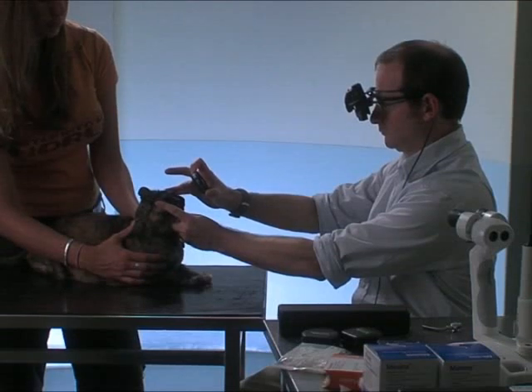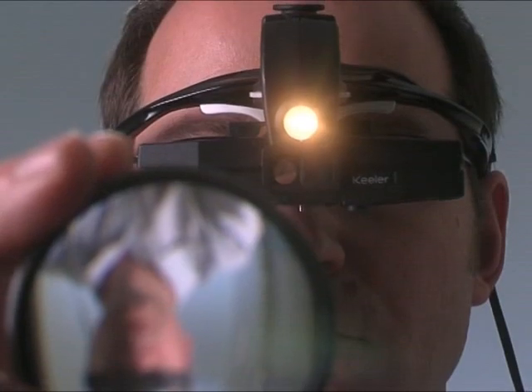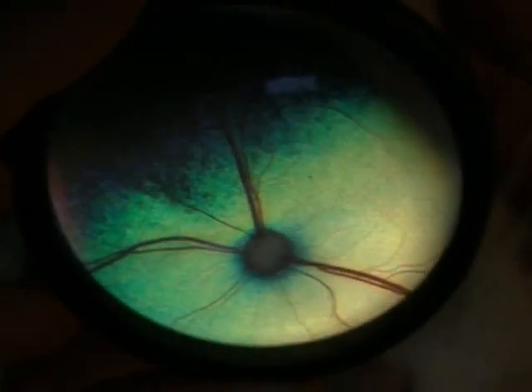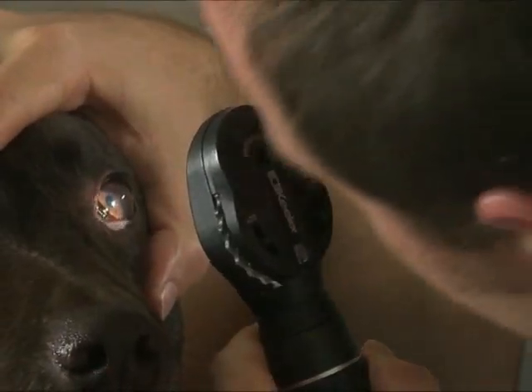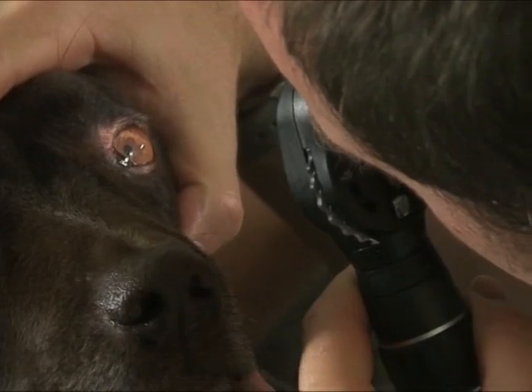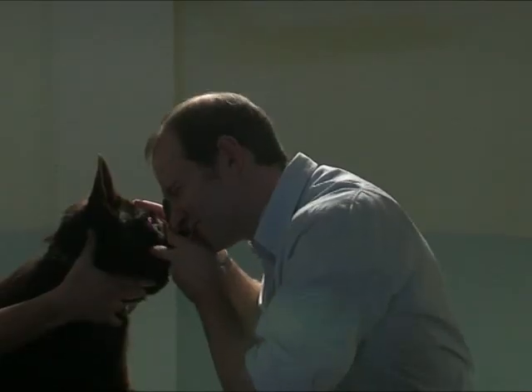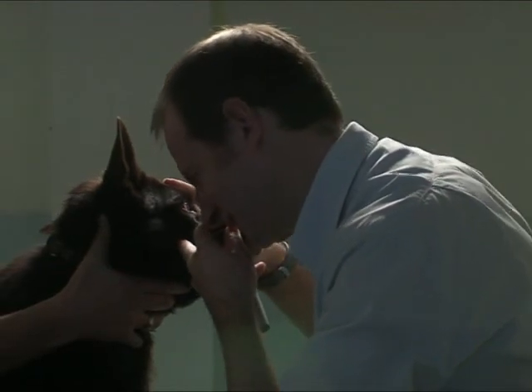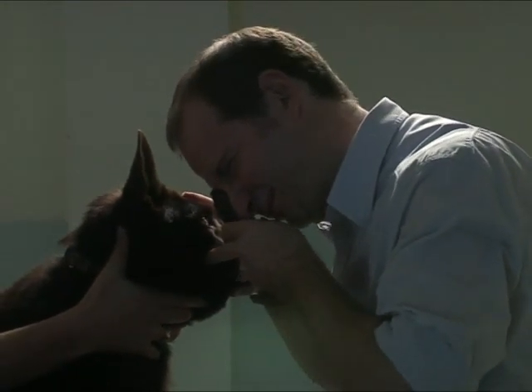Indirect ophthalmoscopy is used to examine the fundus via an image created using a lens. Hence, the fundus is viewed indirectly. Fundic examination is technically challenging, but there is much to be gained from becoming familiar with both the direct and indirect techniques, bearing in mind that each has advantages and limitations.